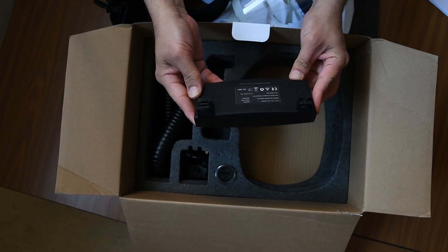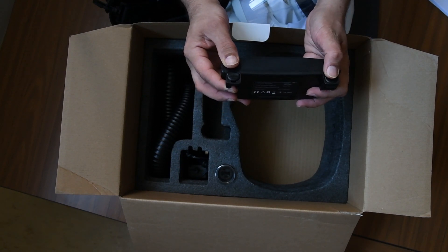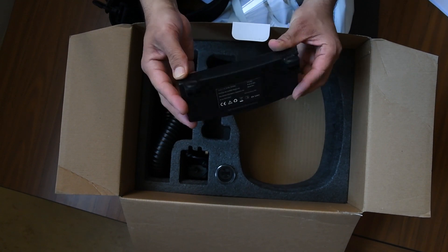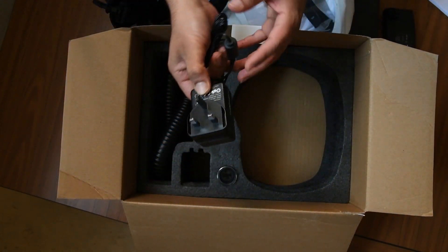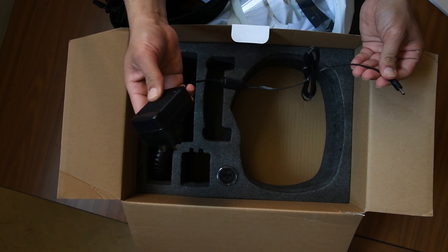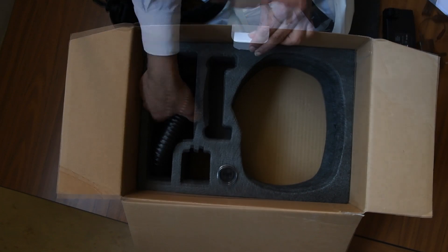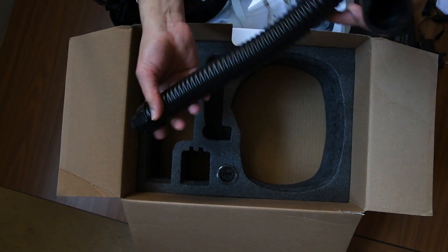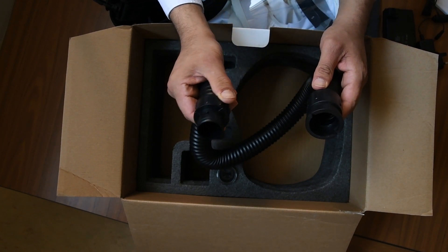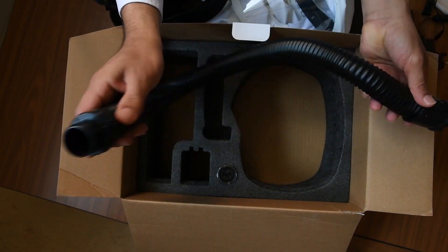This is the battery pack, which is a lithium-ion battery, and it has these buttons here. This is the charger for your battery and it has an indicator light. This is your flexible tube, and you can use the attachment which is provided — it's very flexible.